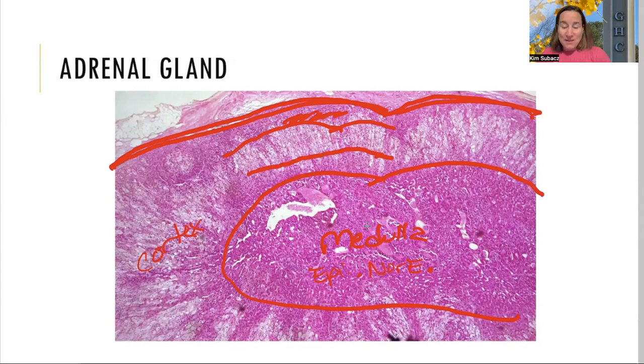So the lighter zone in the cortex, it's the middle one in the sandwich. So our middle one is zona fasciculata. That's this one. Again, this lighter zone is fasciculata in the cortex. The fasciculata is going to be in charge of glucocorticoids. So your glucocorticoids are stress hormones. So if you are stressed, you're going to need energy to do stuff. So you've got cortisol, and so that's a glucose-sparing one.